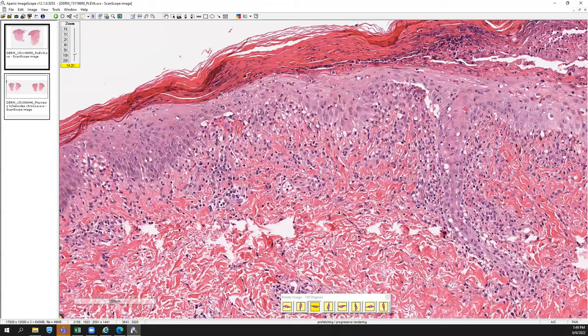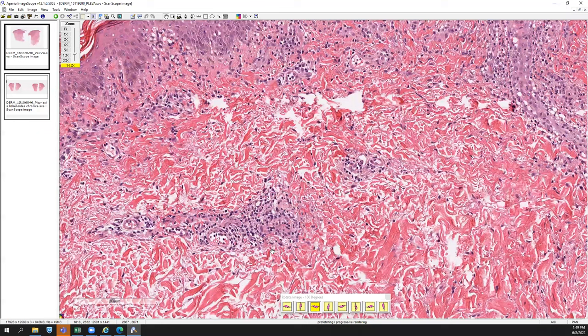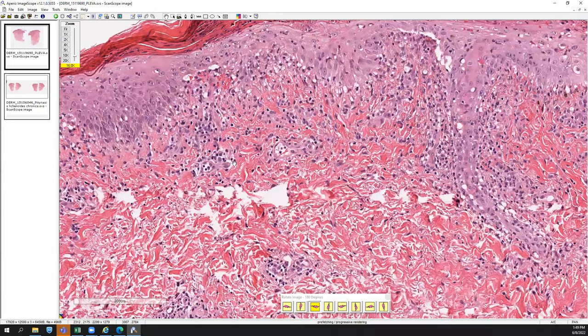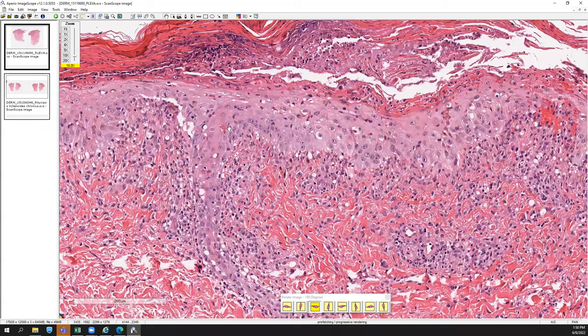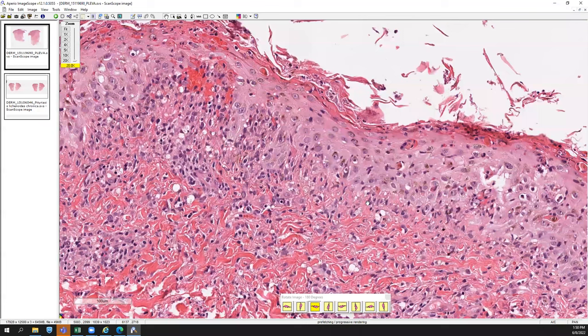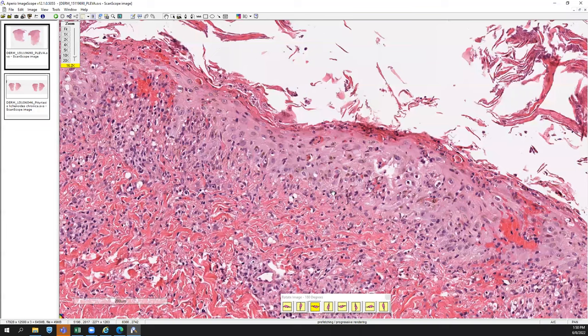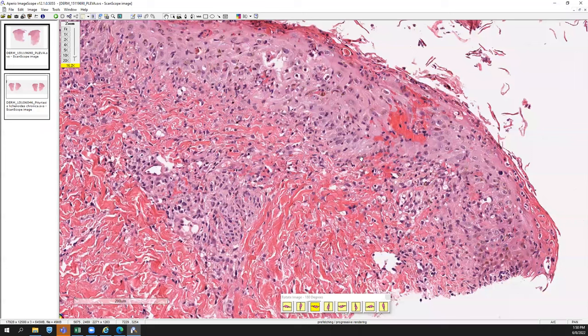Overall this is an interface lymphocytic process, but you also have some areas of perivascular lymphocytic inflammation and surrounding erythrocyte hemorrhage. So we've established that this is some type of perikeratotic lesion with an interface change, some perivascular lymphocytic inflammation, erythrocyte extravasation, and apoptotic keratinocytes within the epidermis. Clinically this was a young patient, and if you are suspecting pityriasis lichenoides et varioliformis acuta — or PLEVA for short — this would be consistent with that clinical impression.